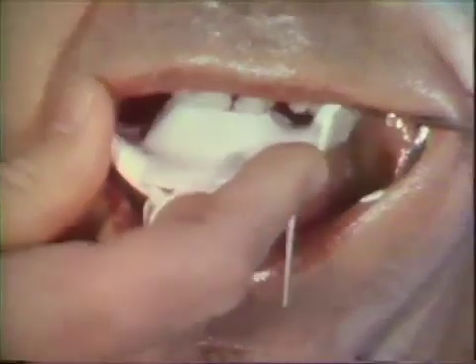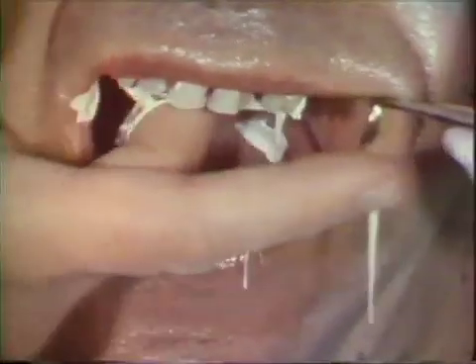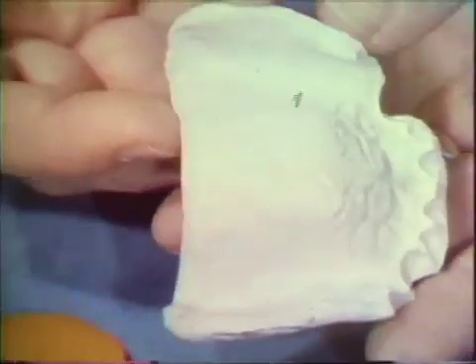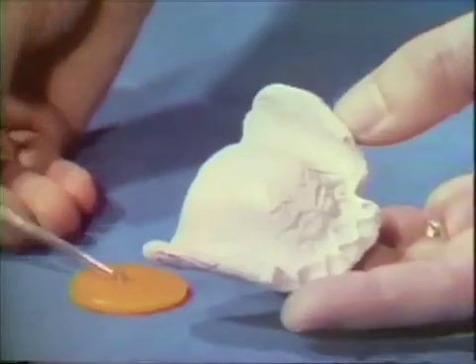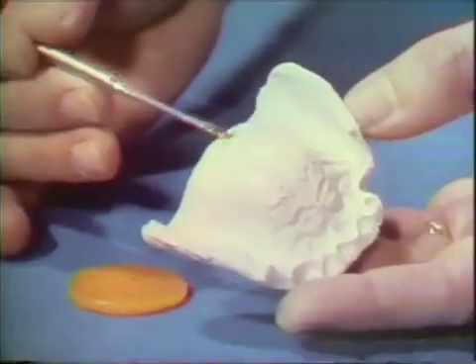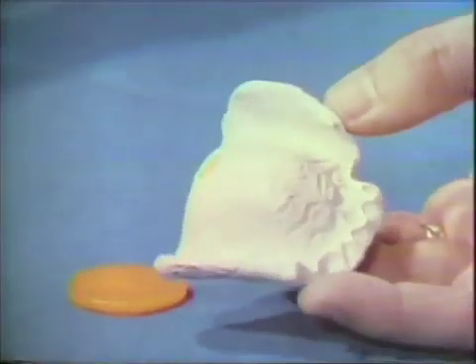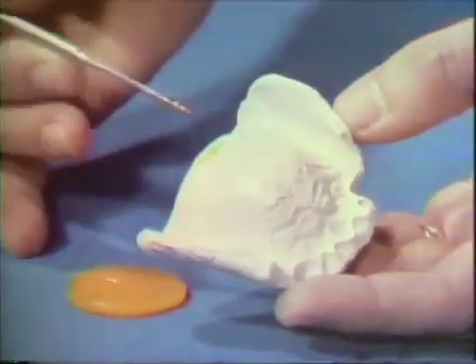Using zinc oxide and eugenol paste, the final impression is made of the edentulous portion of the mouth. The excess impression material is cut away and the functional post-dam added to the impression. This is one of the advantages of this type of impression for the immediate denture patient.